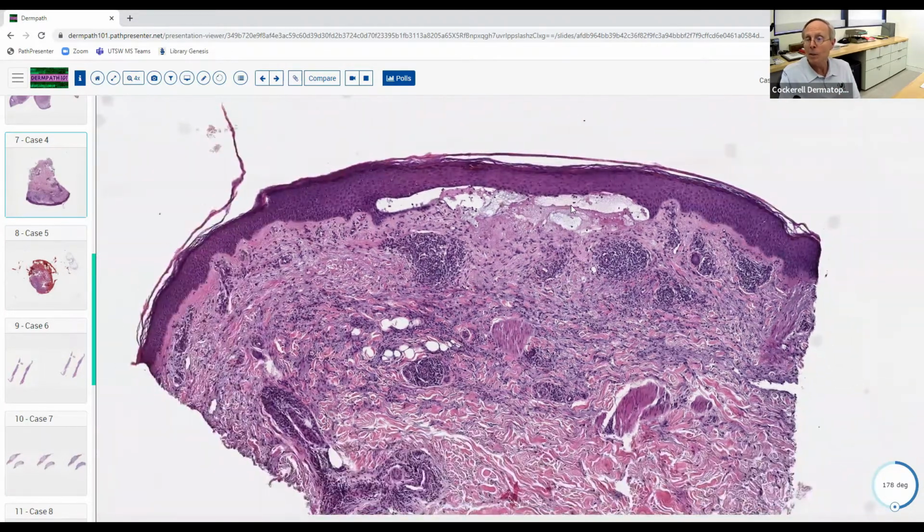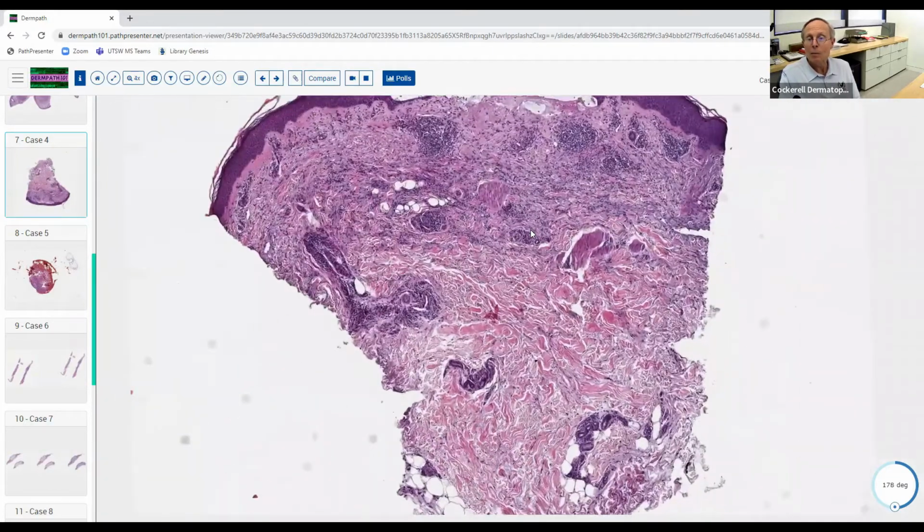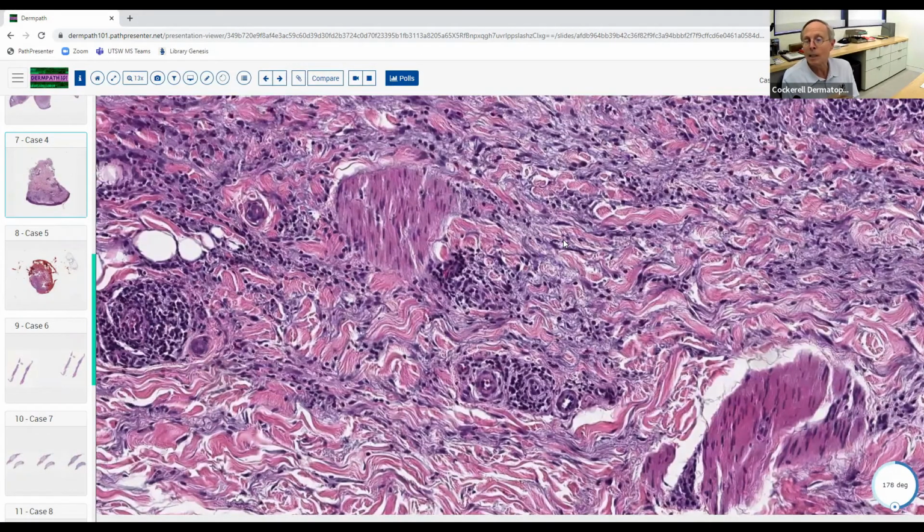It's got this pattern here that's a little bit of a distractor, and it's got some scattered eosinophils, which is a little bit funny. But the main thing to remember is the differential diagnosis of the interstitial histiocytic palisaded granulomatous pattern, because there really aren't too many diseases that give you that. And there's one other entity that you should know about, being pathologists, that can simulate granuloma annulare, but it's actually a malignancy. There are actually two or three things. Do you have any ideas of things that can look like interstitial histiocytes, but are really more of a neoplastic process?